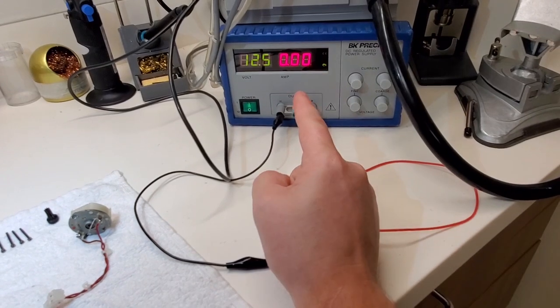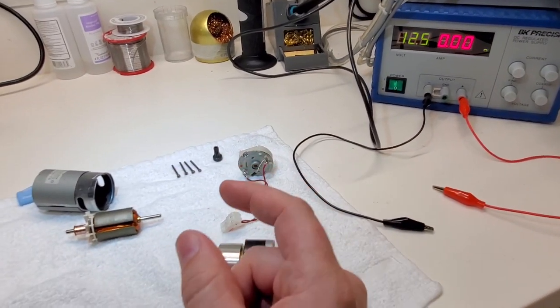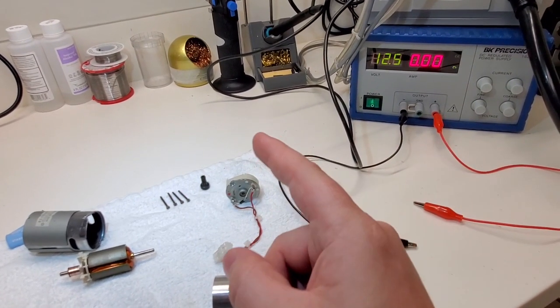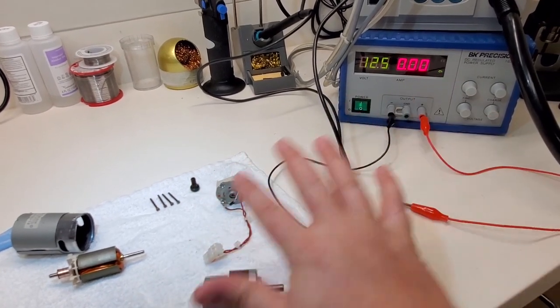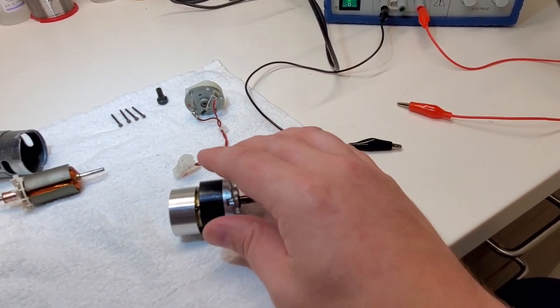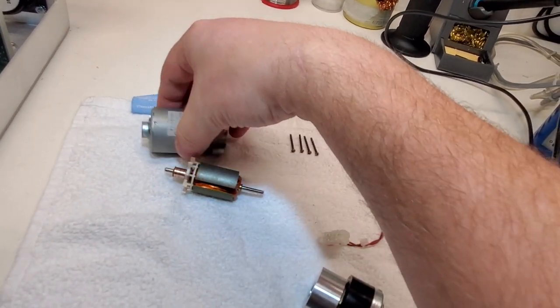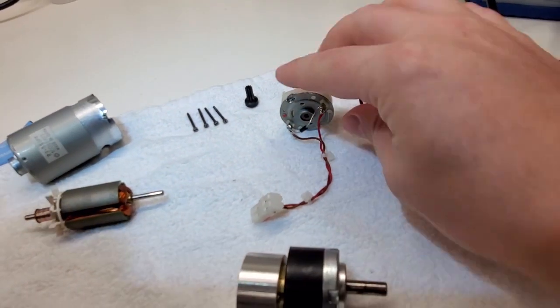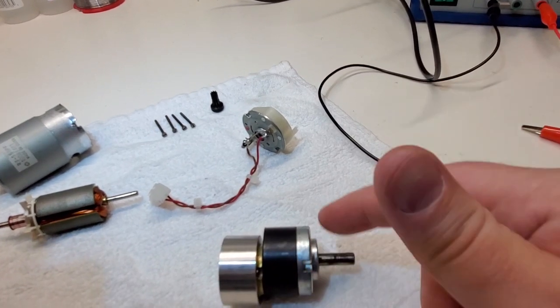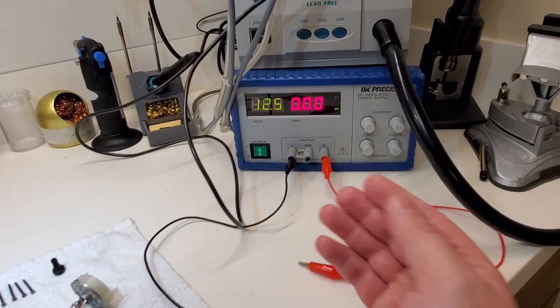So I increased the current and I set it to about an amp and a half at 12.5 volts. And then I spun it and it acted very sluggish. It started spinning almost like it was in a dead spot. And it started spinning up and then it started going faster and faster. And I was not changing anything here. And when you have that, it is usually an indicator of long time grease, especially in planetary gear sets, or your bronze oil bushings, like at the input and output of your motor. Those bronze bushings will sometimes be contaminated and maybe even start wearing on your output shaft. But anyway, sometimes it would spin at 12.5 volts, sometimes it would not.